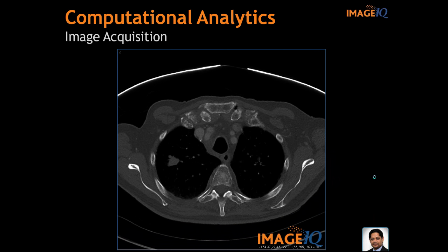I highlighted areas where the radiologist compared this particular scan to the previous scan and made measurements, but it's very unstructured. You wouldn't necessarily get this for a clinical trial. You will actually have a CRF that has specific measurements of specific target lesions that you're looking at. Very, very structured, right?